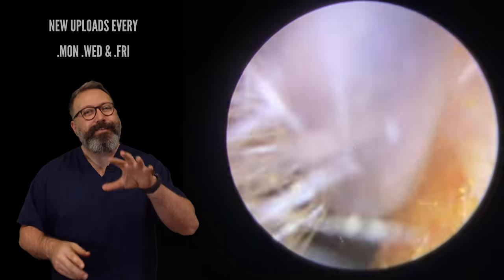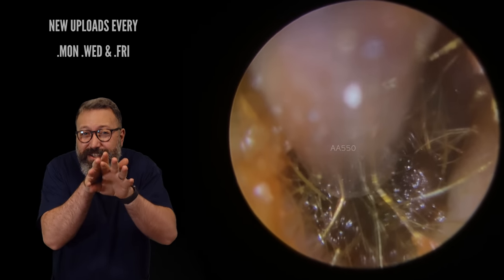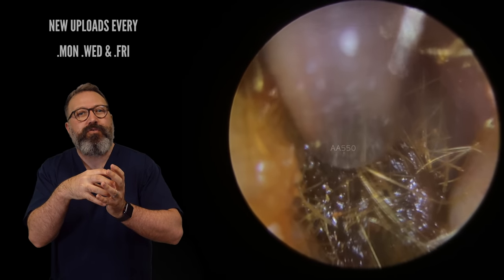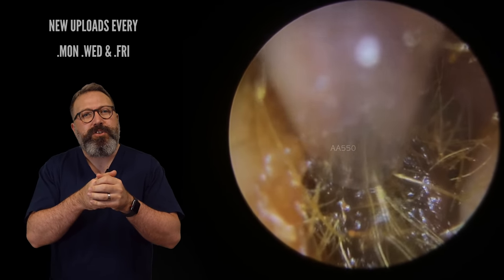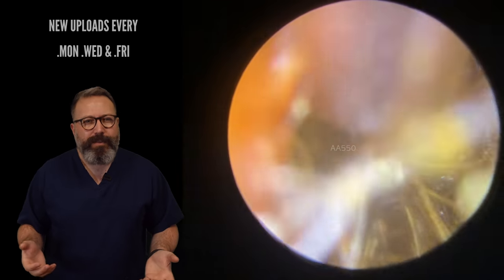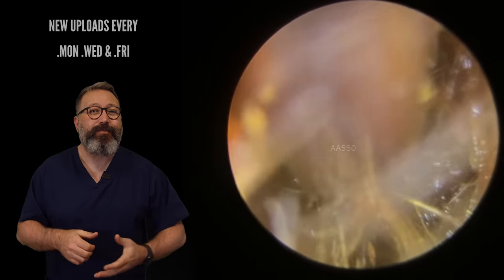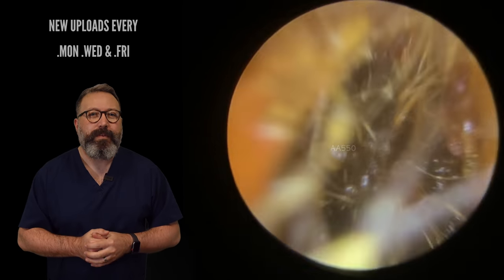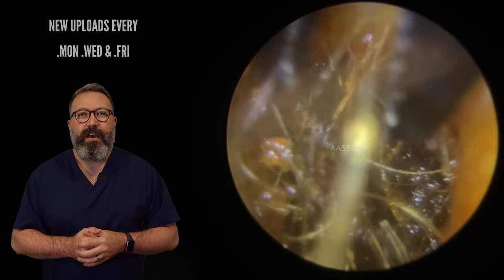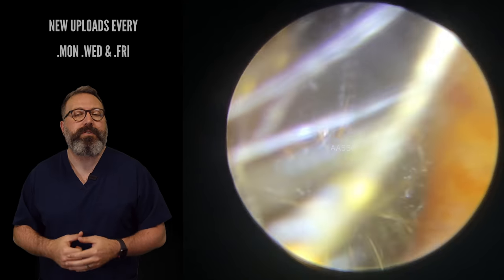We're going to take a look at this last little section. This was really hairy — we've got to be really careful because those hairs are jutting out at all these different angles. If you press against that, you're going to push those hairs against the eardrum, which can feel a little bit uncomfortable for patients. So we're just getting a grip on the side, drawing this down. It's like Kerplunk — if you ever played that game, we've got all these bits kind of overlapping one another, like a porcupine with lots of hairs all sticking out in different angles. The difficulty when the hairs jut out like that is you can't always get a good suction grip, so I've switched now to the crocodile forceps.